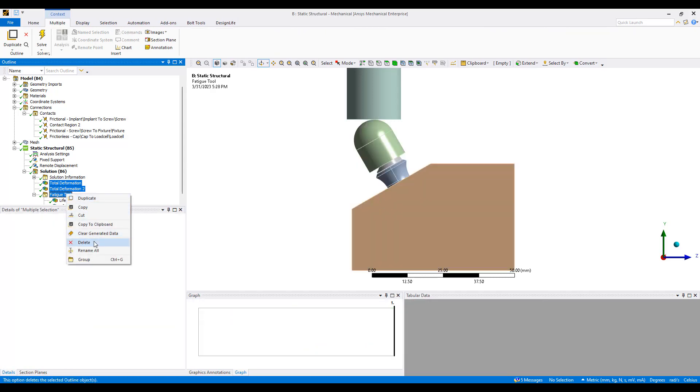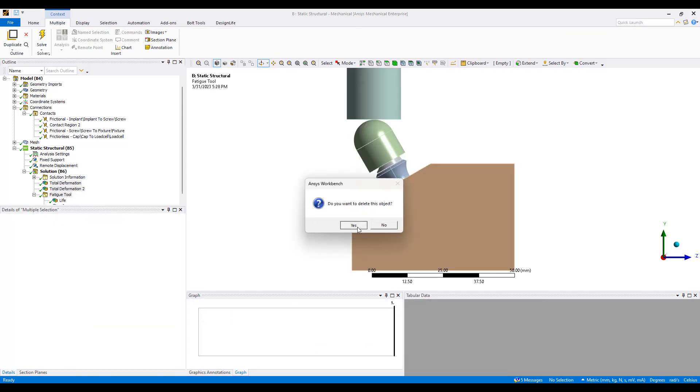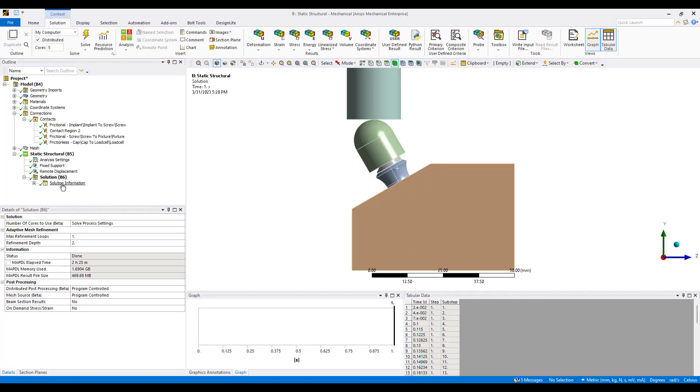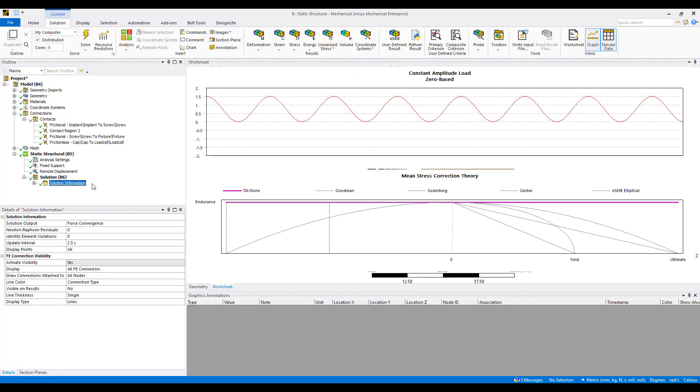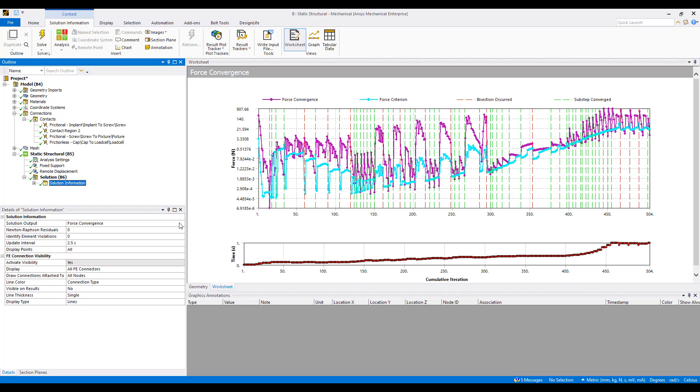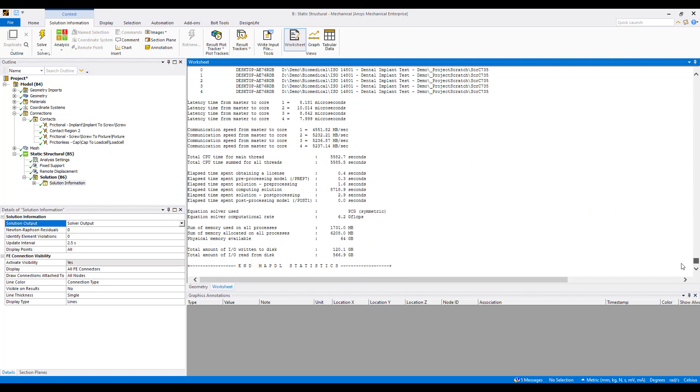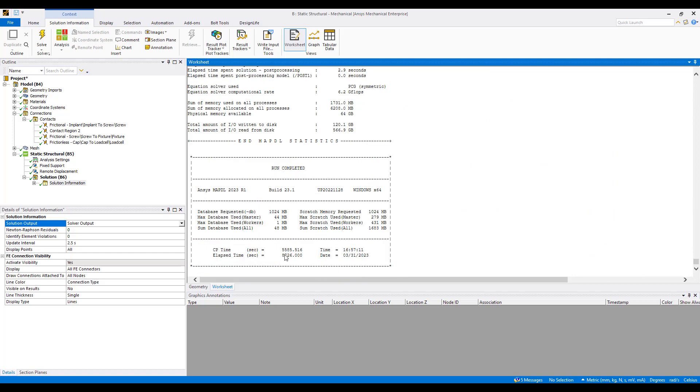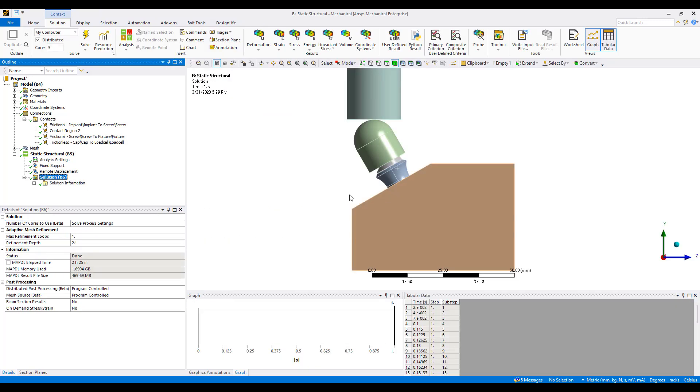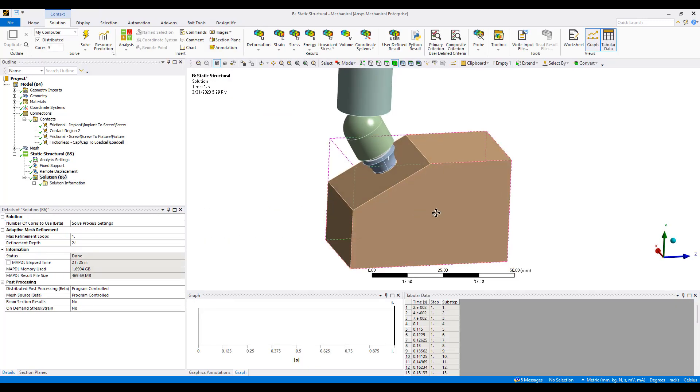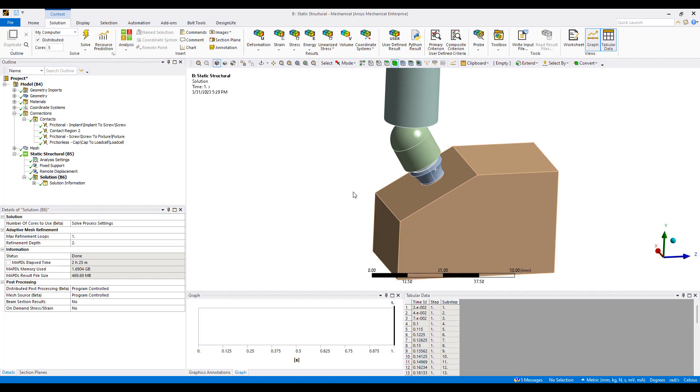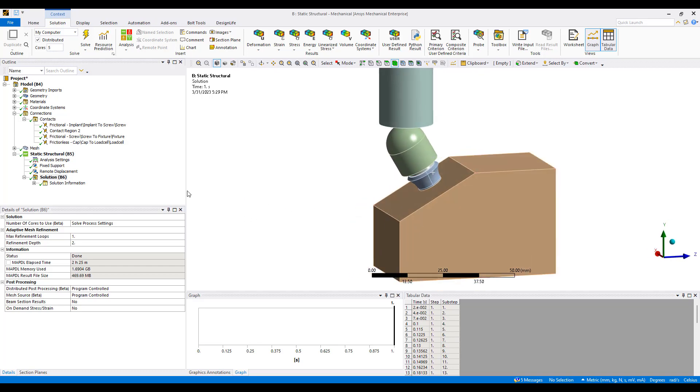It takes a while to run the simulation so I'm going to jump to the results here. This simulation took 500 iterations. Running on my laptop here it probably took about 6,000 seconds, about an hour and 40 minutes to run the simulation which is not too bad. With more computational resources, more cores, a little bit faster machine this could run much faster.